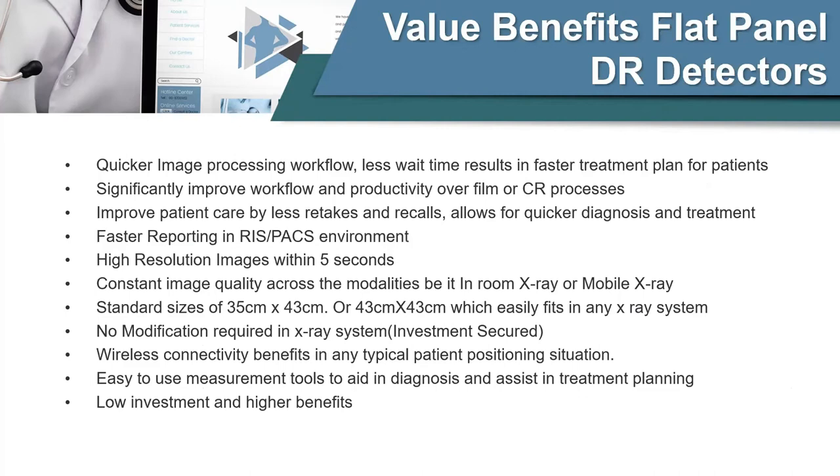So what are the benefits in ADR? You have quicker image processing, and a significant improvement in workflow. The patient doesn't need to be taken out and in, so there are fewer problems for the patient. You don't need to recall the patient again. Faster reporting: immediately the image is transferred into a PAC system where you can see the image. High resolution images, and then constant image quality. You maintain a constant image, it is not deteriorated. You get good quality images either in the X-ray room or in the mobile also.